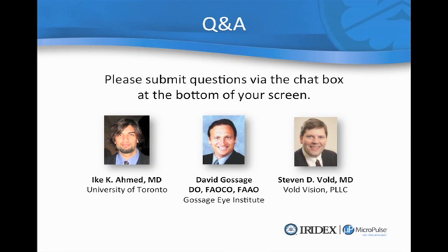Okay, and a couple questions here with regards to David's comments about your retina applications. I wonder if you can give further details about your parameters for retinal laser. Sure. When I'm treating the retina, the nice thing about this is it's completely different than what you're used to with continuous wave laser. You have to remember that this laser in the micropulse setting is really what we call foveal friendly. It's a great laser to treat with because you can come right over the fovea without the risk that you would get with, say, a continuous wave laser.